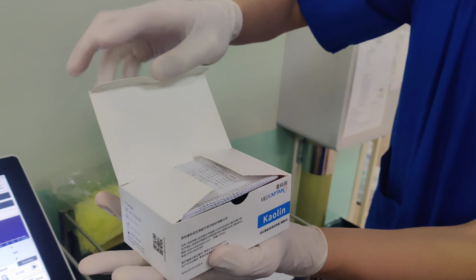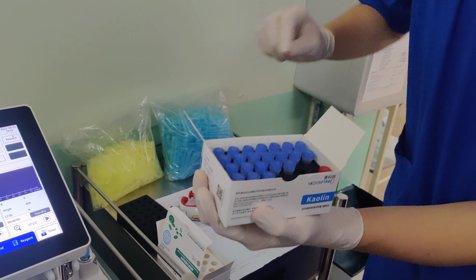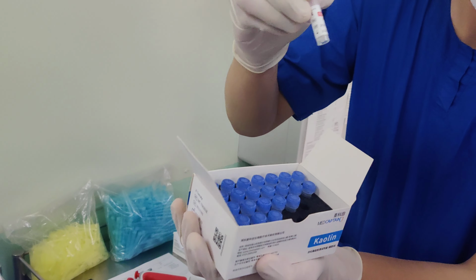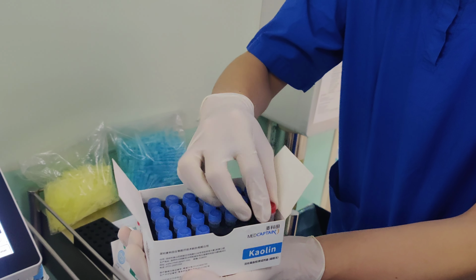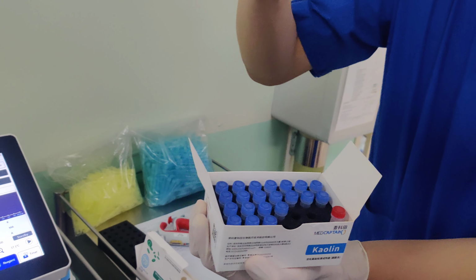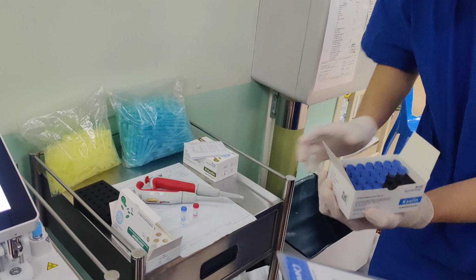Okay? Inside here, we will require 2 things. Okay? We require, one is the trigger. This is reusable. One box only have one. This is essentially the calcium ion to kickstart the coagulation process. And then every test we will use 1 kaolin bottle. So after use, this one will discard. Okay. So one test we will require these 2 things.